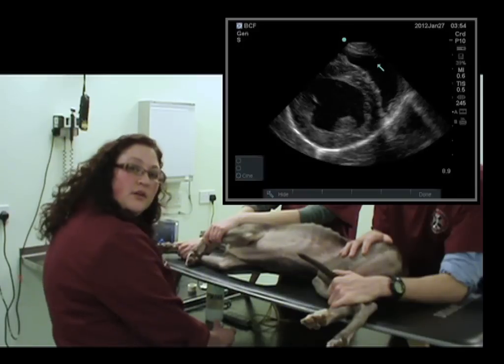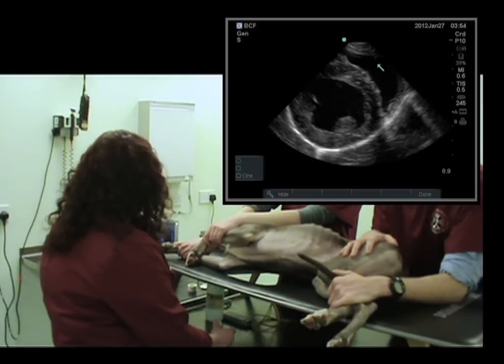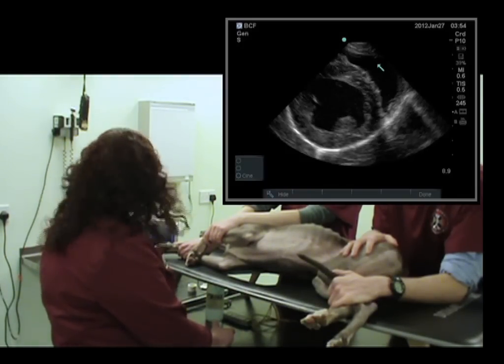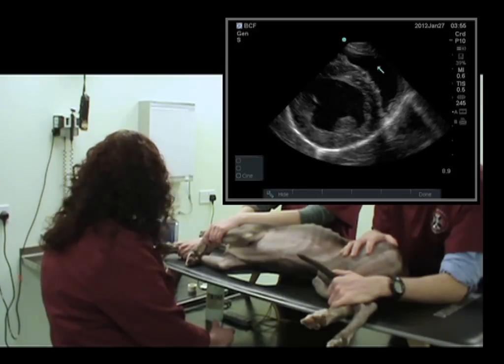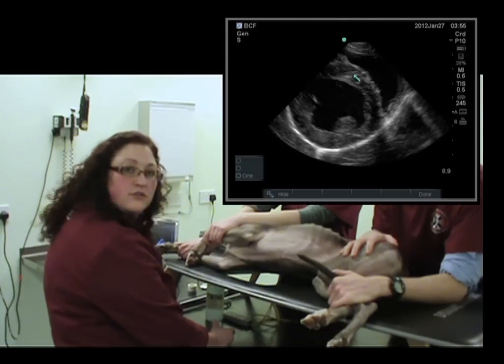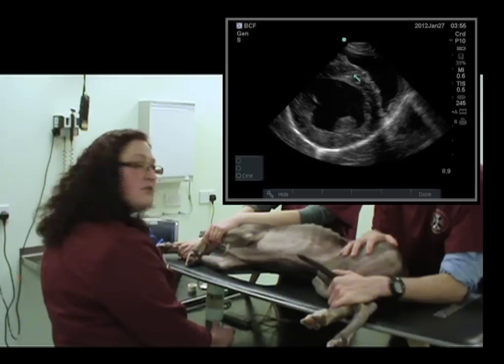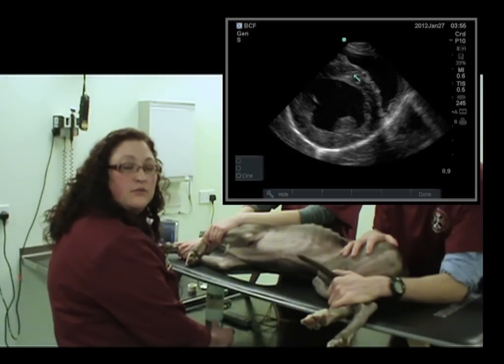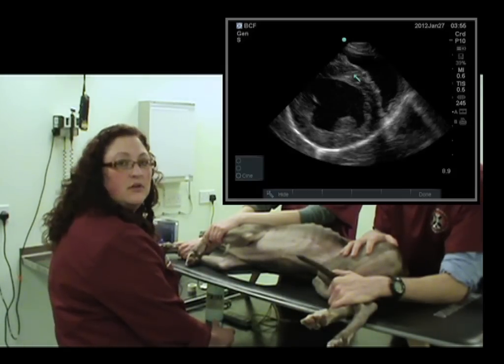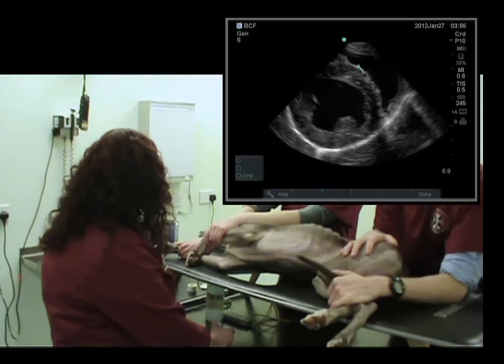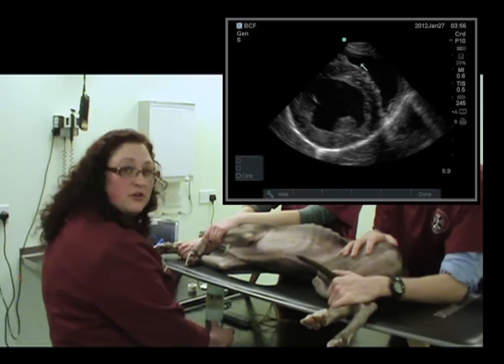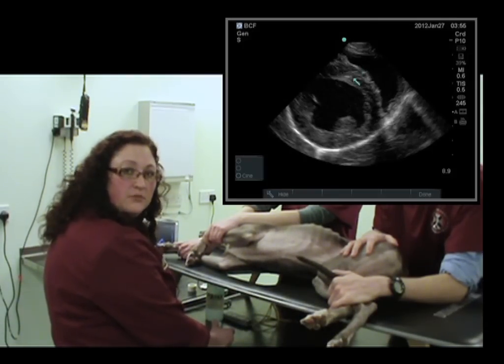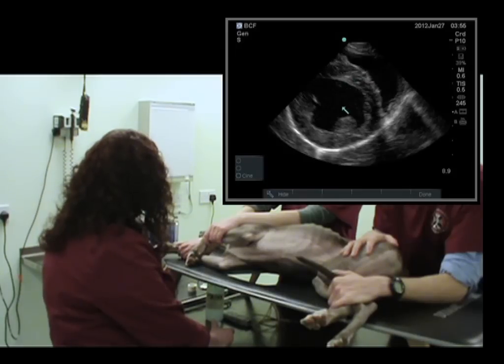What we can evaluate in this view is how round the left ventricle looks. If there's flattening of the interventricular septum, that can give us a little bit of an idea that there may be increased pressure within the right ventricle. As the right ventricle has greater pressure, it actually flattens out the interventricular septum towards the left ventricle.